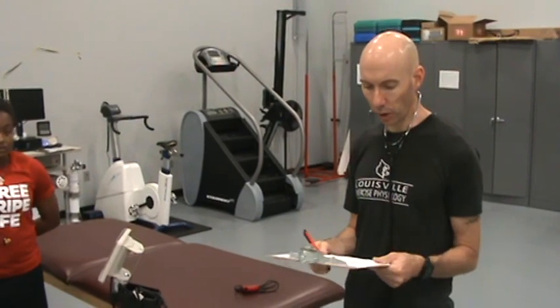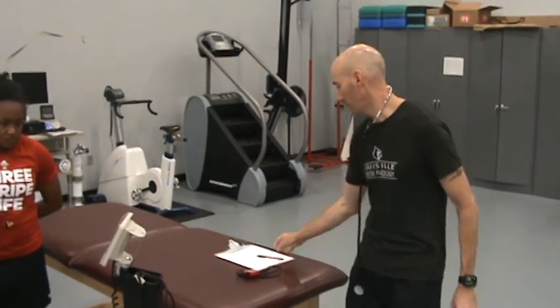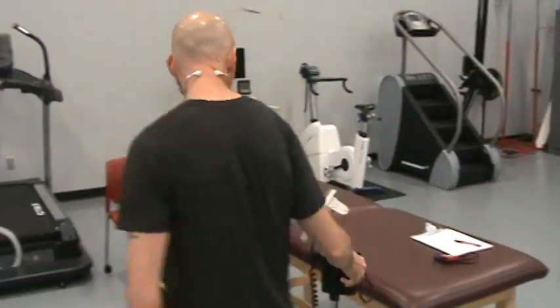Now again, that does not always happen. That's kind of what would happen in a perfect world. Has not necessarily happened here with Lindsay, but when you're answering the questions on the lab and on the exam, I want you to tell me what we expect to happen as somebody moves from these three body positions. Okay, so let's go ahead and get Lindsay's last measurement. We're gonna get her standing blood pressure now.